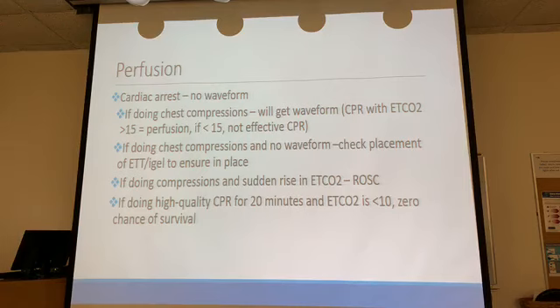What happens after doing that for 3 minutes? The guy's getting tired. You see that end-tidal CO2 start going down and now he's not getting above 15. All right, it's time to switch. So that's another way you can use it. If you're doing chest compressions and there's no waveform, then you need to check the placement of your airway, okay?